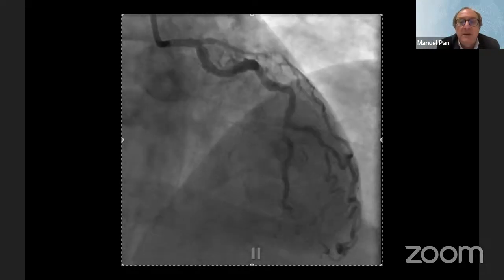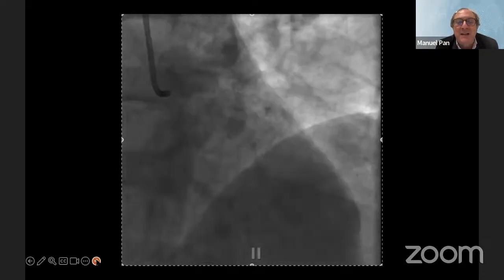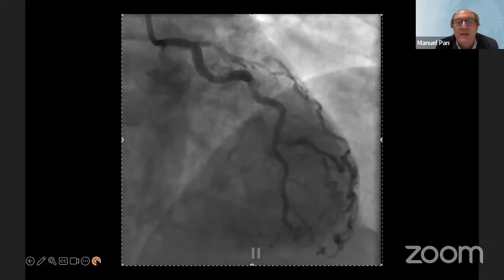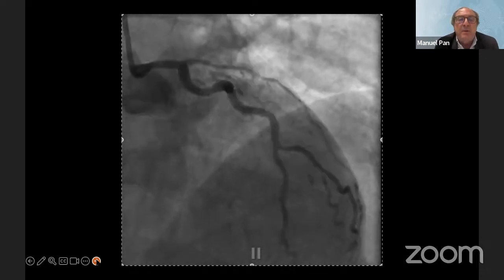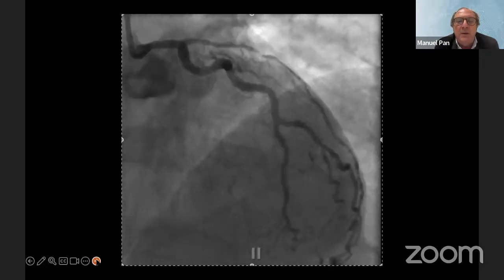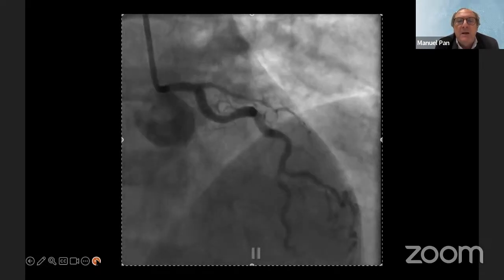Yeah, it's a very difficult procedure. You have an ostial LAD occlusion and then a side branch starting at the body of the CTO. So my approach probably would be to use the IVUS in the circumflex in order to make a puncture of the proximal cap.